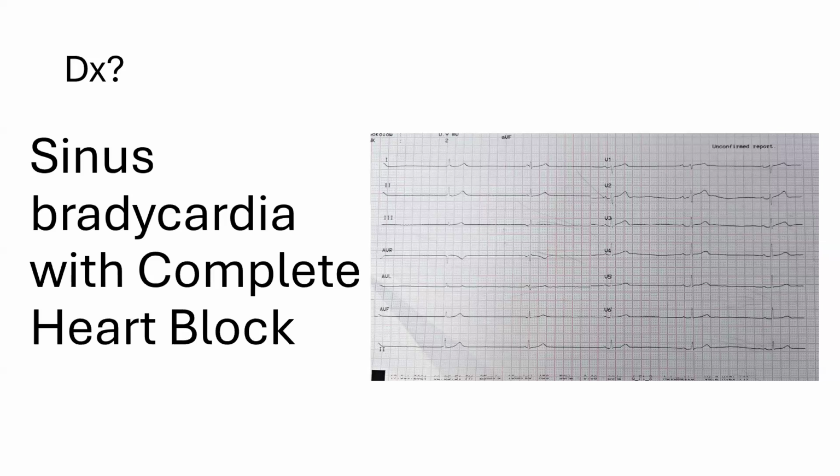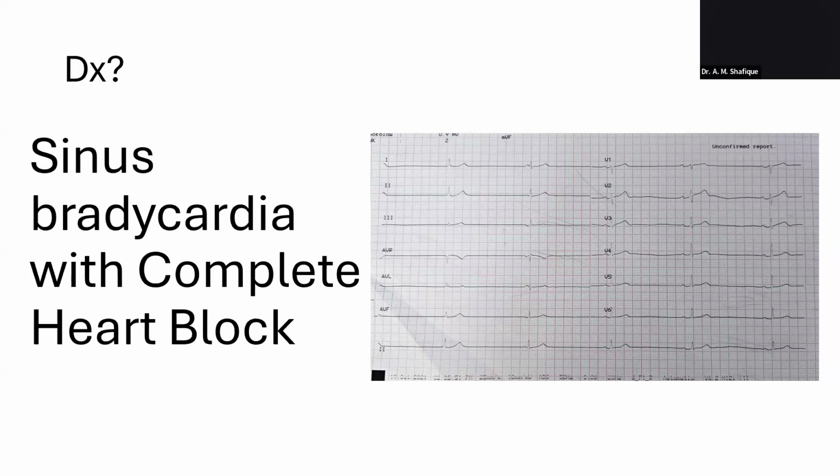It's not. But I have gone through a few slides on the internet. It is said that it is sinus bradycardia with complete heart block. This type of ECG, I have gone through a few ECGs. So they defined it as a sinus bradycardia with complete heart block.